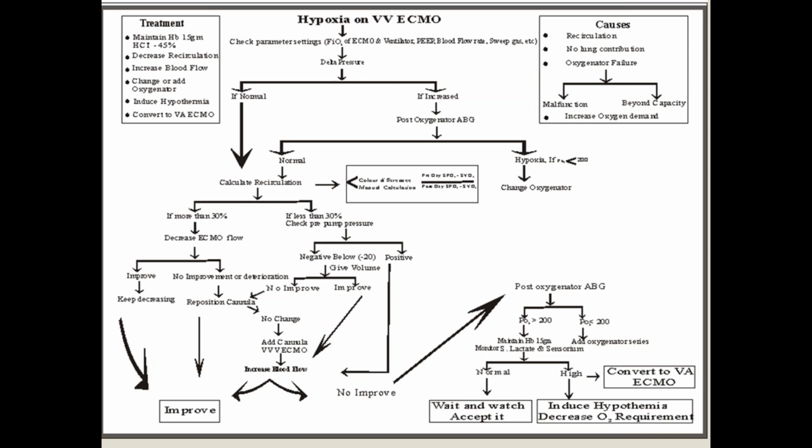If you have a jugular line, you usually put a jugular line on the left side. So if you have a left-sided jugular line which is away from the returning cannula, and it does not enter the RA, then you can take it from that. That is reliable. If that is not there, the only way you can collect is from the femoral, which will be somewhat reliable as compared to others.